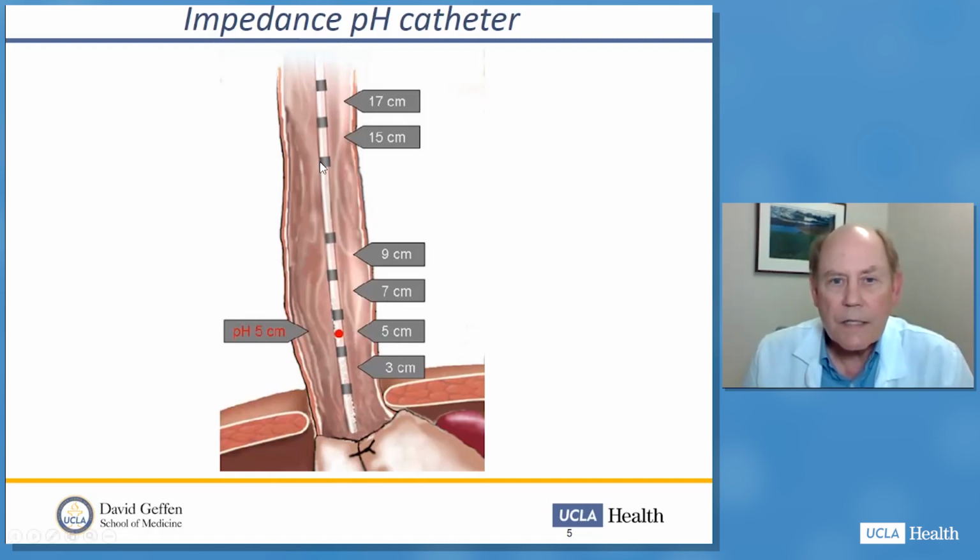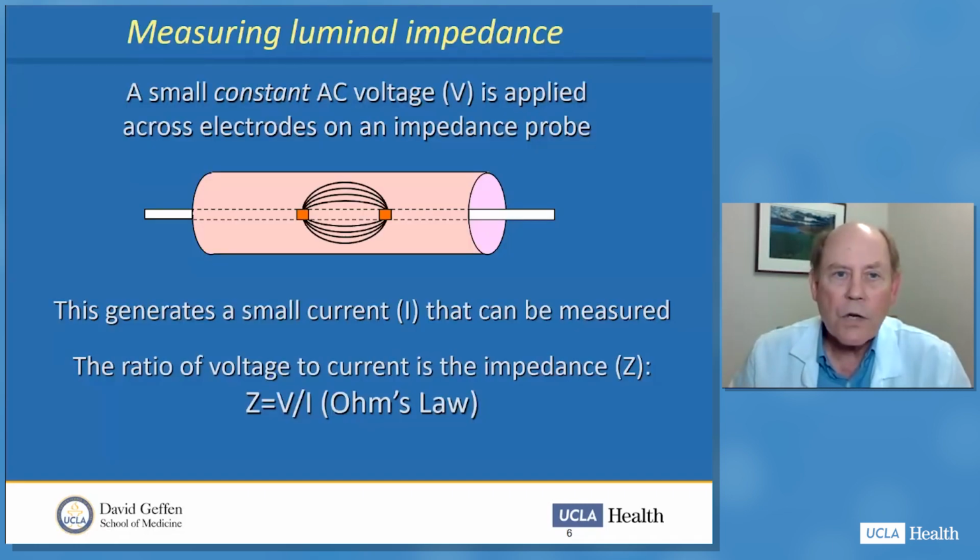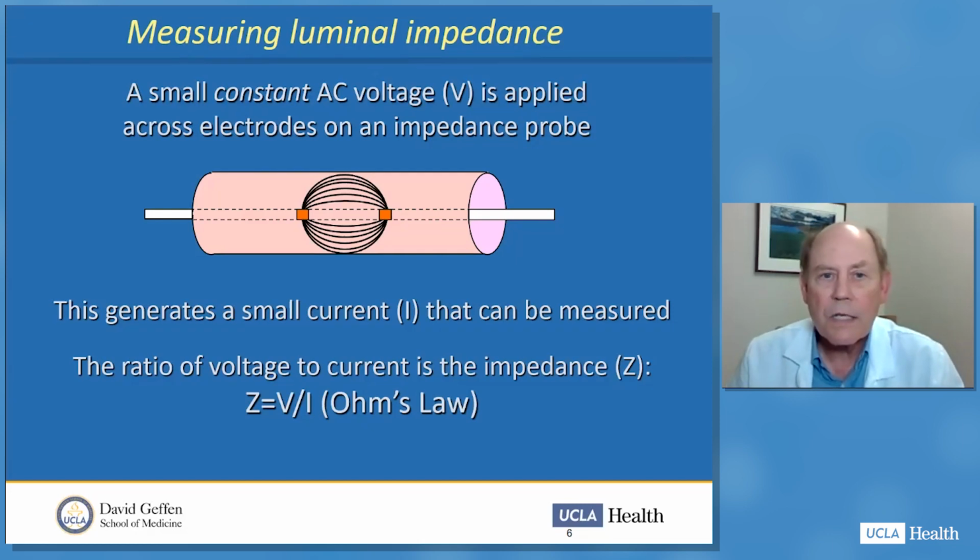Notice that these sensors, these electrodes, are free in the lumen of the esophagus. They're not enclosed by anything, and that's important in understanding what we're going to be looking at. So when you measure luminal impedance, a small constant AC voltage is applied across electrodes on the impedance probe. This generates a small current that we can measure. And since we have a constant voltage and we can measure the current, according to Ohm's law, we can calculate the impedance or the resistance. So, simple equation, it's just Ohm's law.